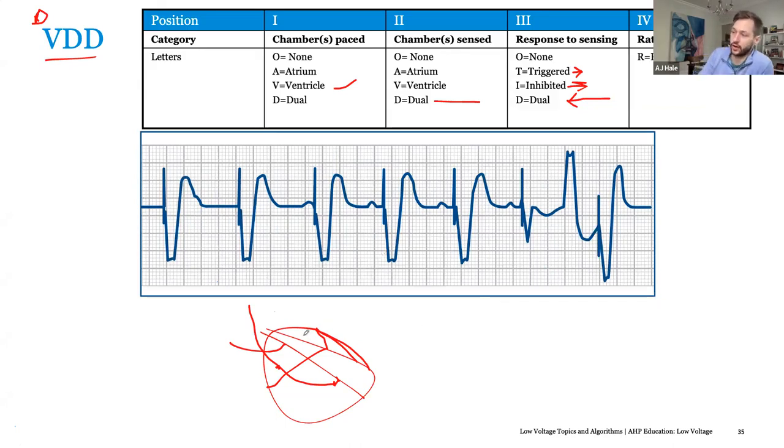They have a functioning sinus. They don't have chronotropic incompetence or sick sinus or anything like that, where we need to control what's happening in the atrium. We know their atrium's working fine. We're more worried about their AV node right here. So in order to circumvent this broken AV junction, we have created a new pathway. And that's with our pace right here.